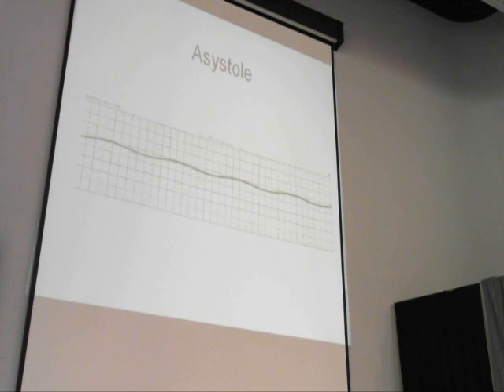There's a little rhyme that used to go with some of the ACLS algorithms for asystole. It says, check me in another lead. You always want to confirm that it is not equipment, it is your patient. So check me in another lead, then you'll have a cup of tea.